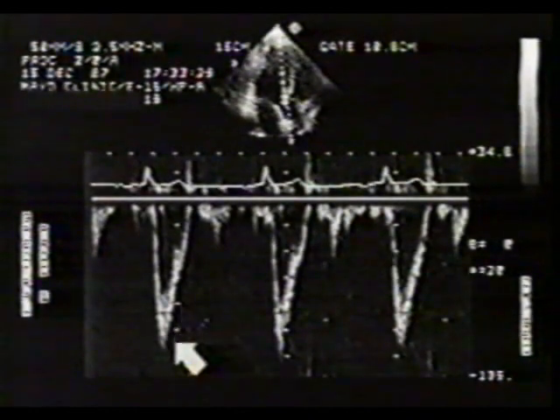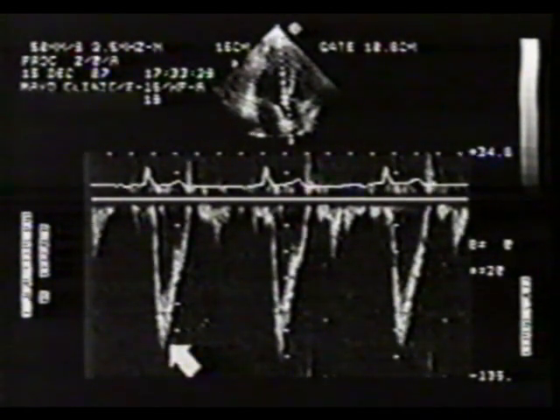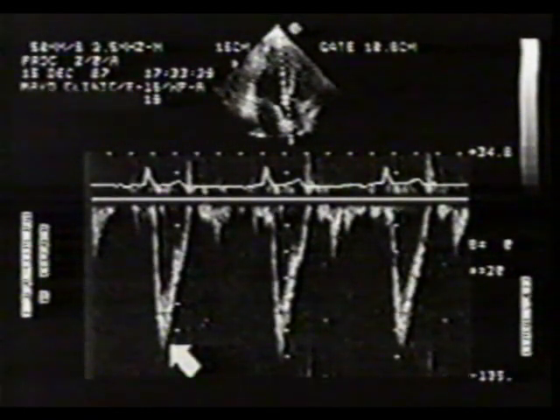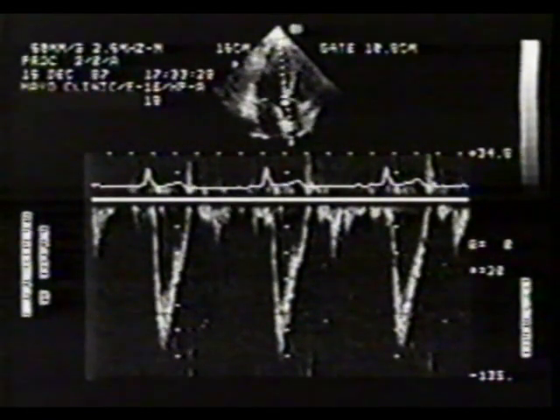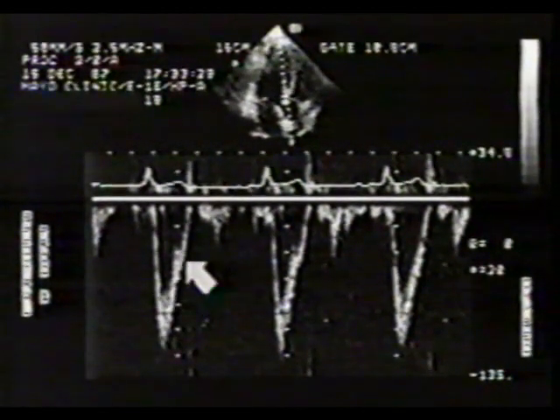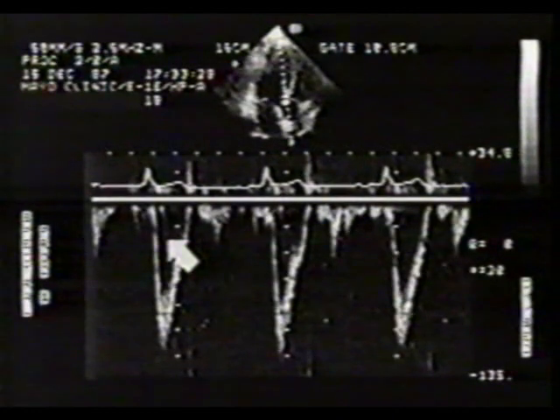The peak here is 1.1 meters per second. Normal velocities can be as high as 1.7 meters per second. Note that the velocity spectrum has a smooth outline with a clear center. This is typical for laminar flow.